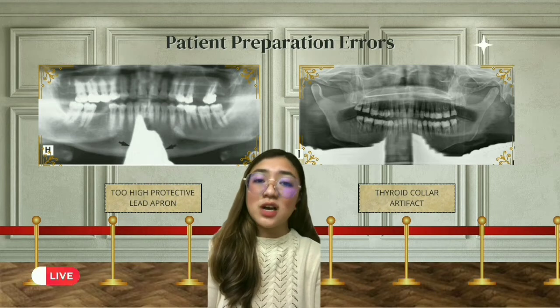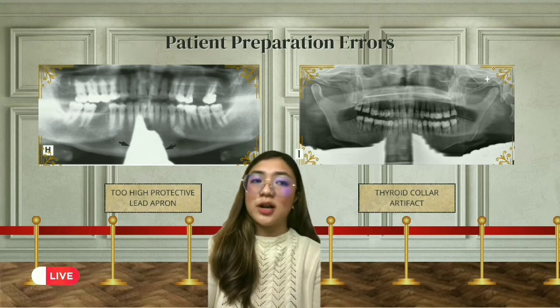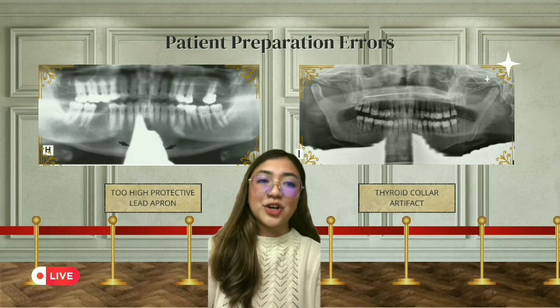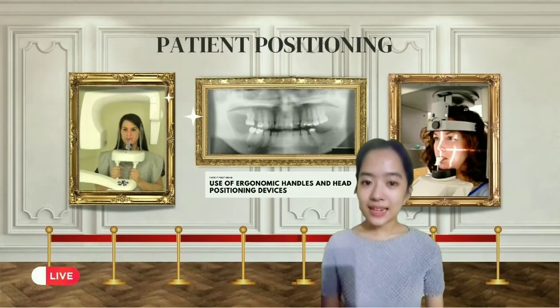So to prevent such artifacts, the dental radiographer must always use a lead apron without a thyroid collar. The lead apron without a thyroid collar must be placed low around the neck of the patient so that it does not block the X-ray beam. So for reiteration, the two most common patient preparation errors are the ghost image, lead apron artifact, and usage of thyroid collars.